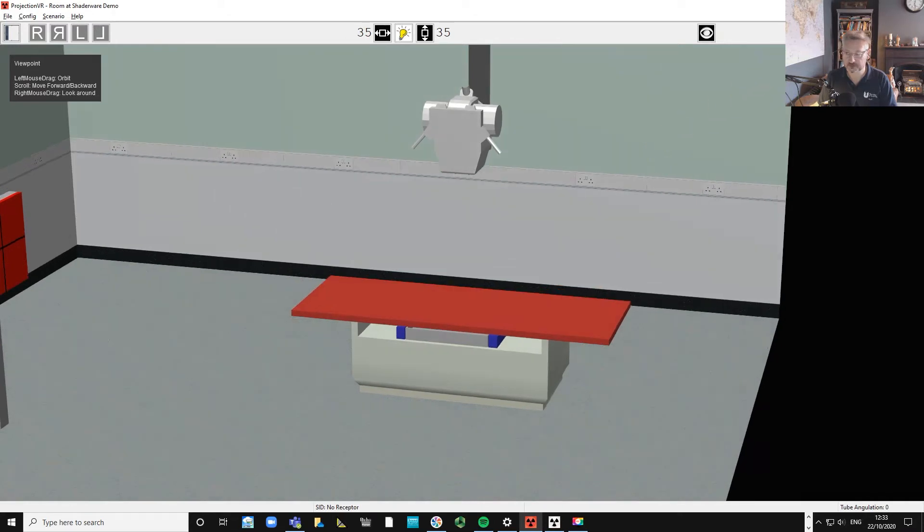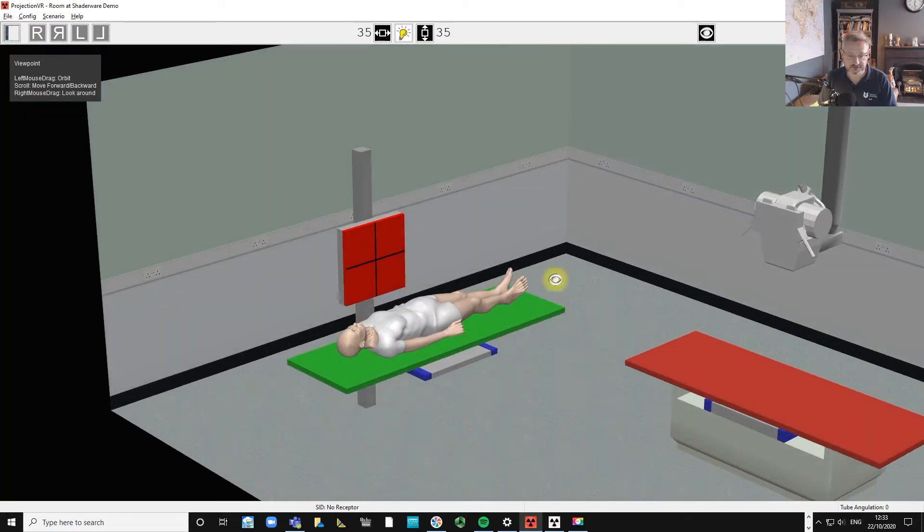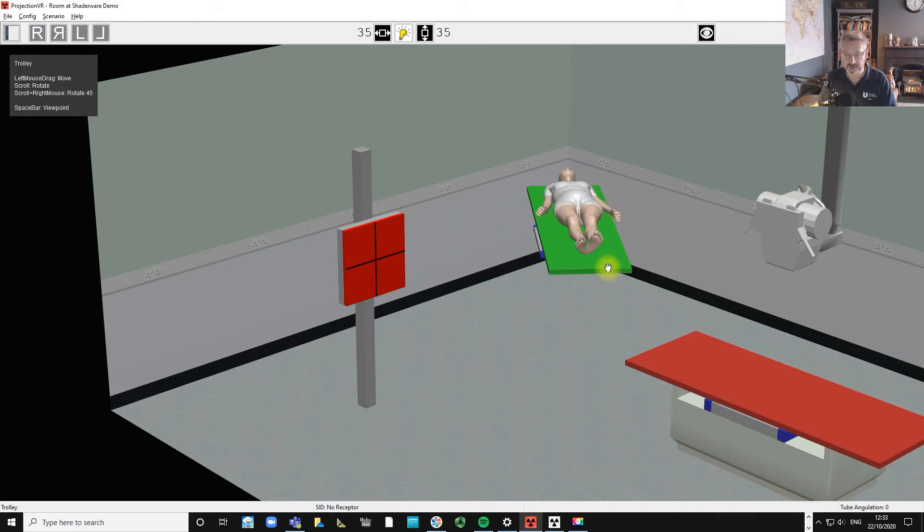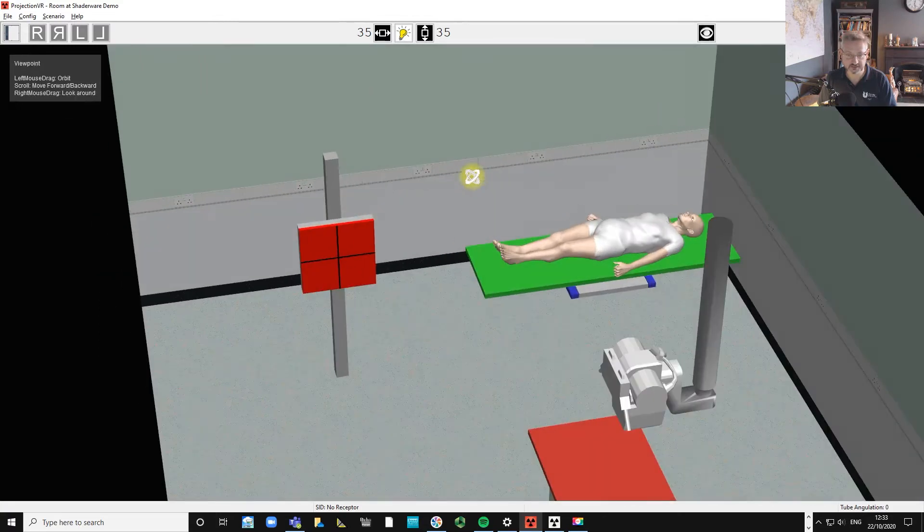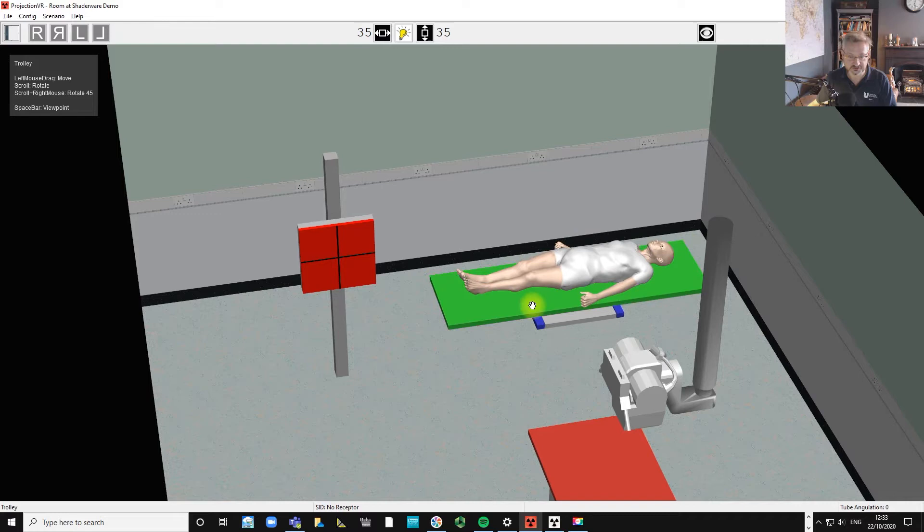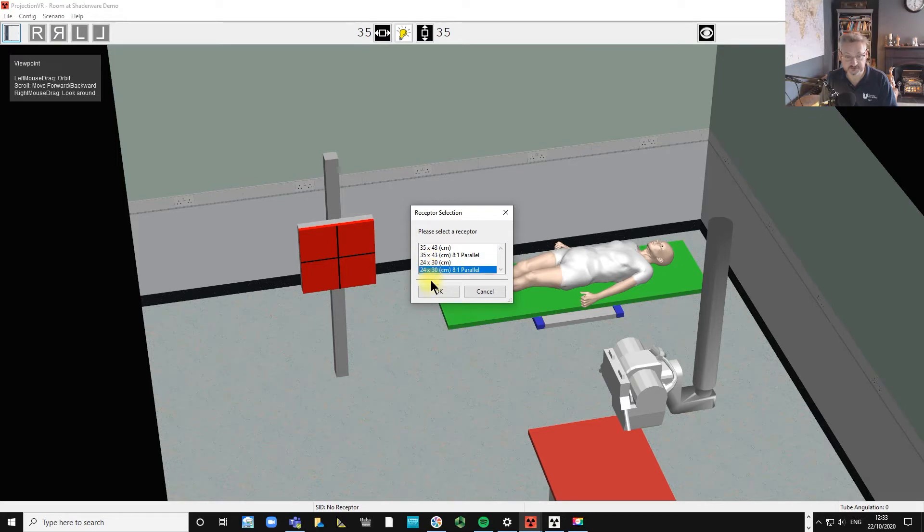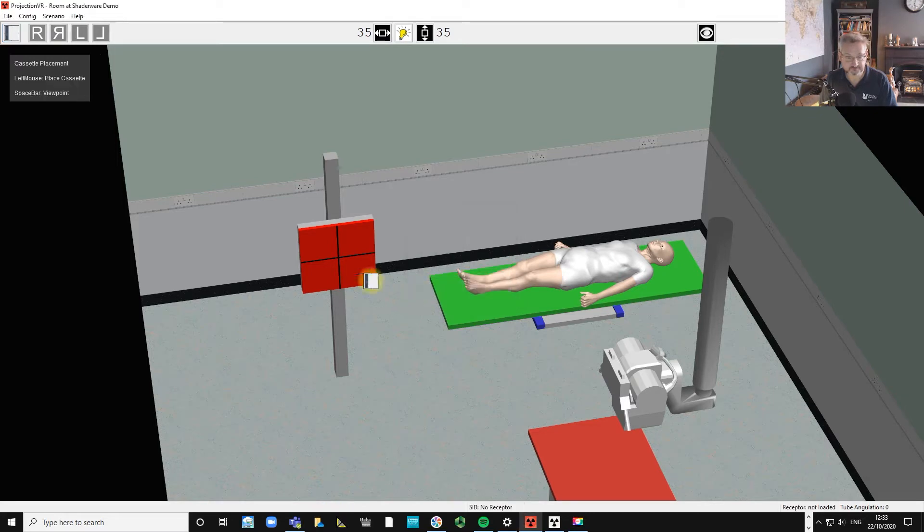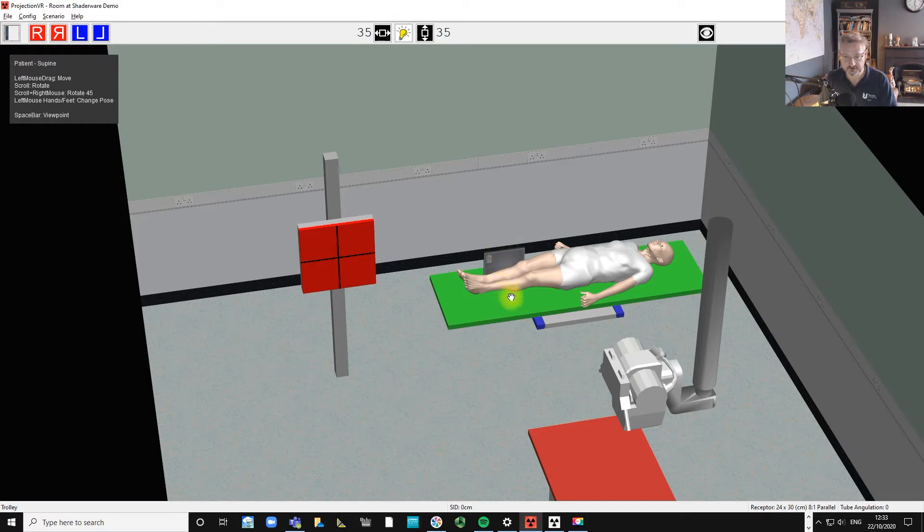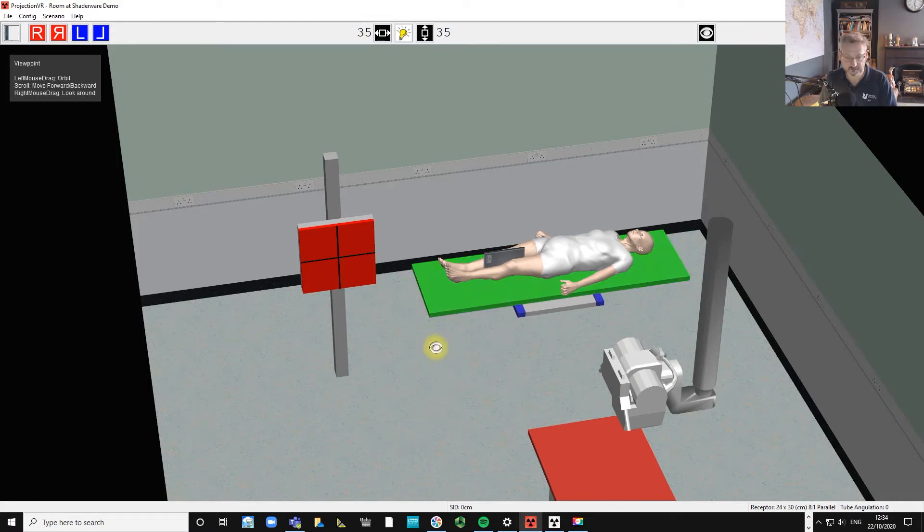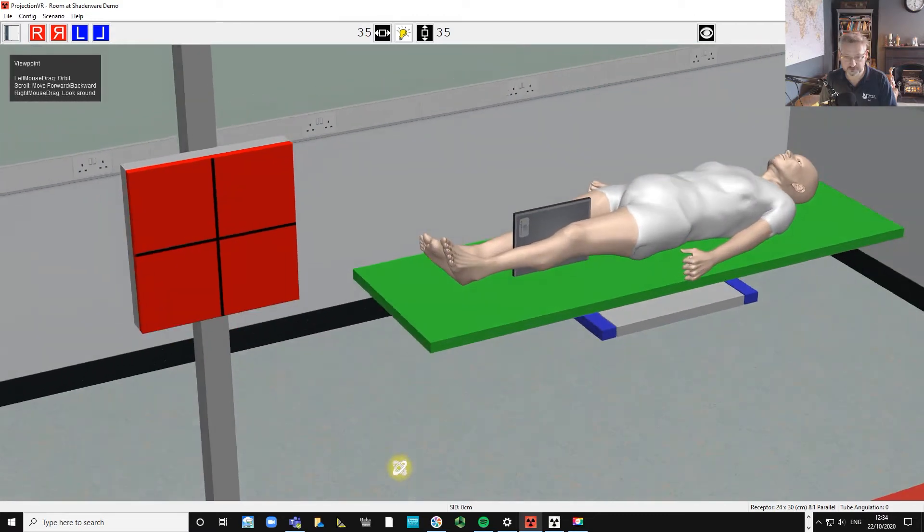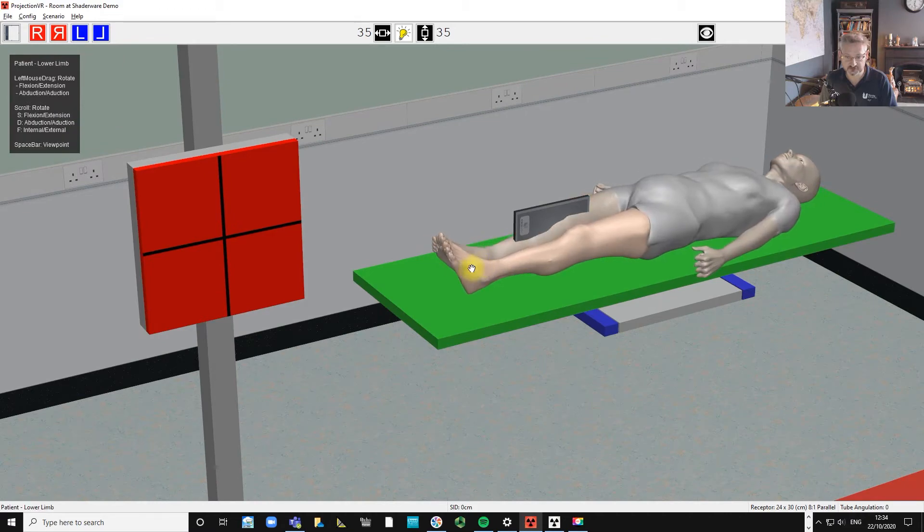I'm going to bring our patient into the room. Now you can do this medial lateral, but I think nearly every radiographer in the land will be doing lateral medial because it's just so much more convenient. So what we're going to do here is pick a receptor with the grid, because I know in our scenario that works way better.